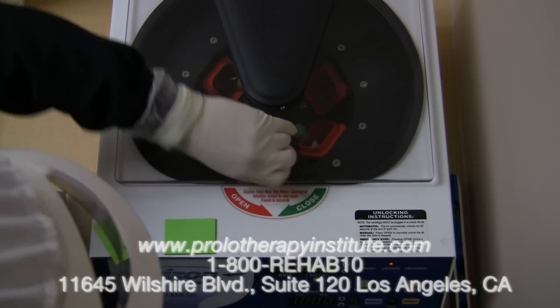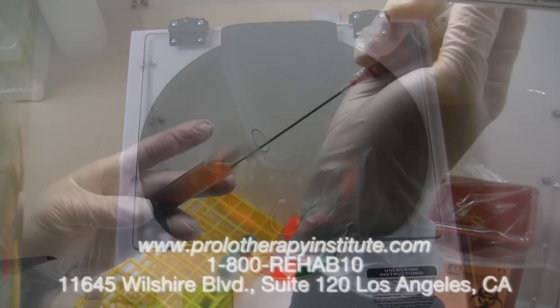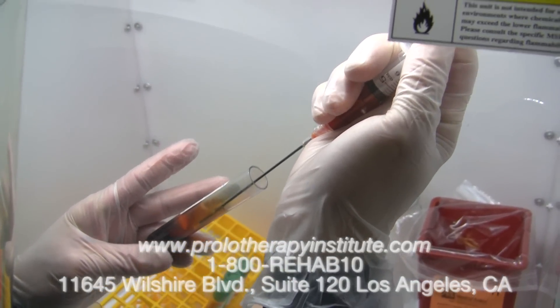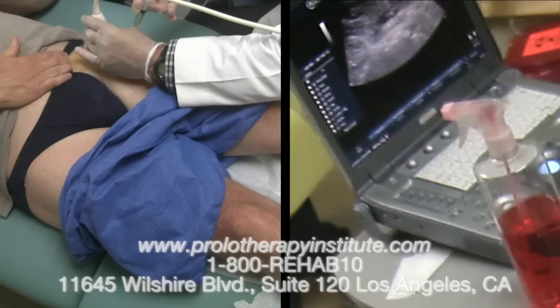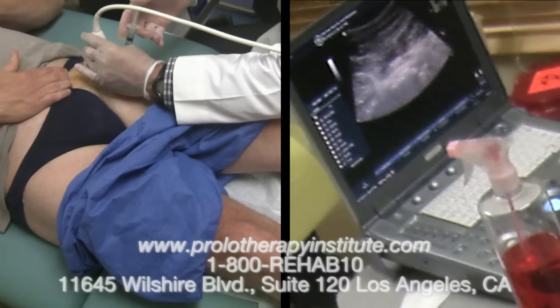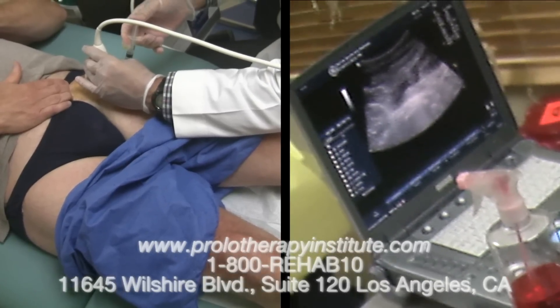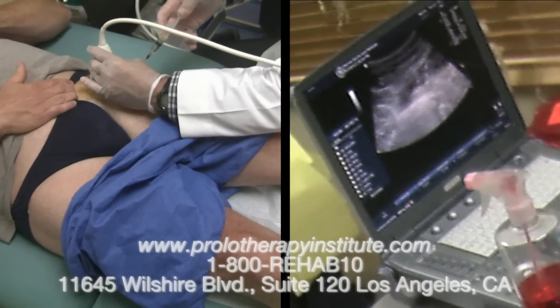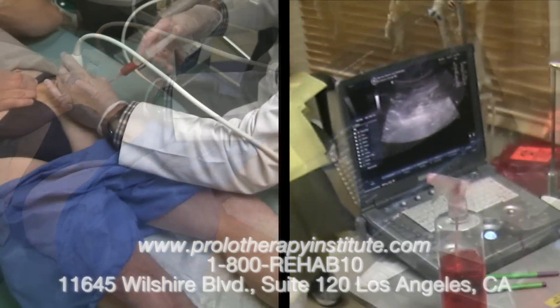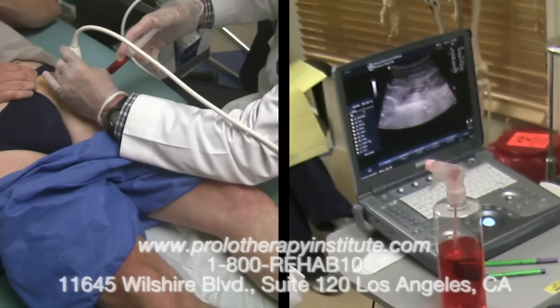The bone marrow aspirate is centrifuged, which separates the stem cells from the rest of the blood that is not needed for this procedure. This patient has suffered from long-standing arthritis of the left hip joint. We're now injecting lidocaine into the area to make way for the stem cells to be placed. We do this under ultrasound guidance so we can actually watch the needle and place the fluid exactly where it belongs.